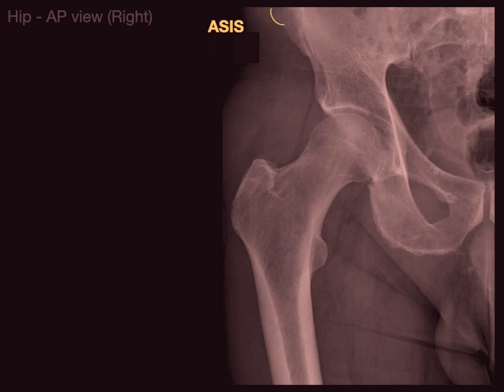This structure right here is showing the anterior superior iliac spine, or ASIS, and then right below it is the AIIS, or the anterior inferior iliac spine.